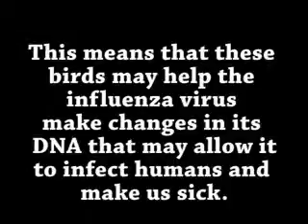So after looking at our slides under the microscope, we found that partridges and pheasants carry both avian and mammalian virus receptors. Learning about the different types of receptors for avian influenza virus is important to learn more about how the virus spreads from host to host. Research in avian influenza is important right now because people are worried about it spreading to the United States and possibly infecting people.